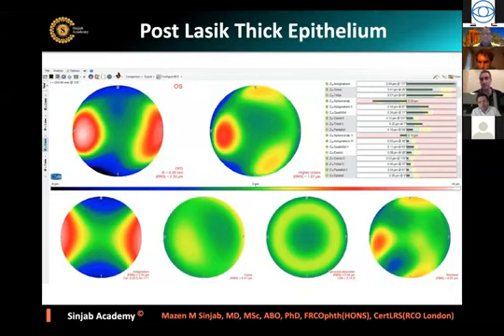Again, I would look at both, look at pupil size, but make sure first that I can get a real good epithelial thickness. Okay, let's assume that this is the worst scenario. Most of it is epithelium. What are you going to do? Are you going to ablate?